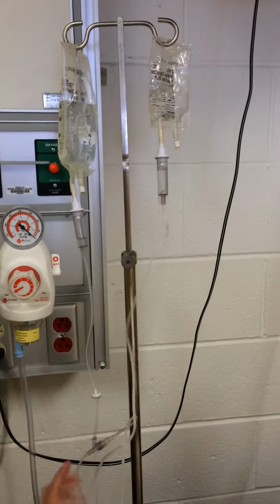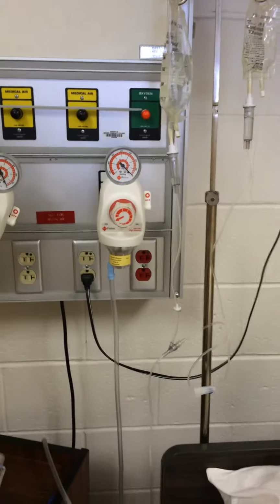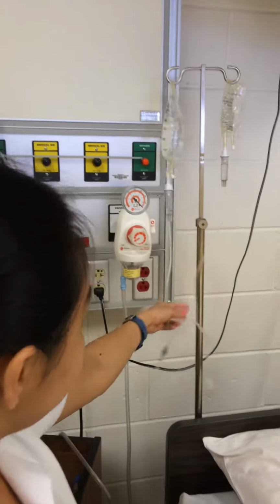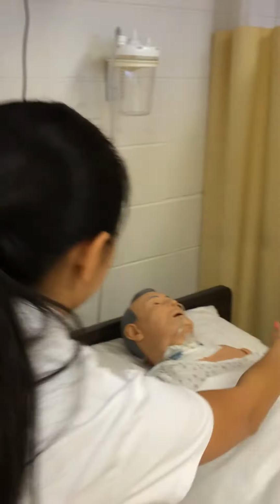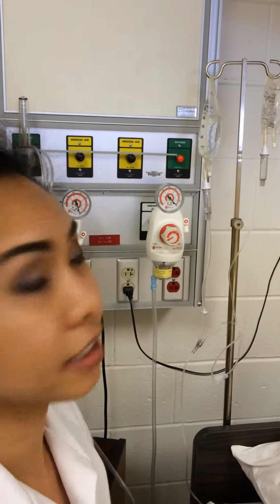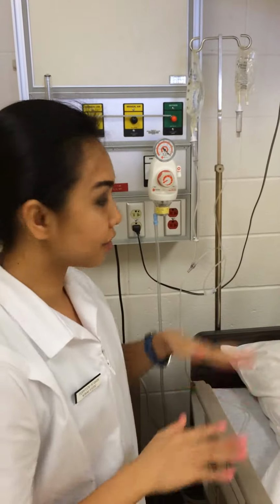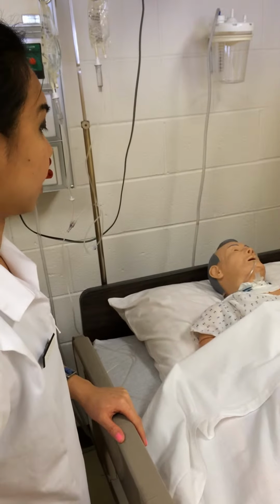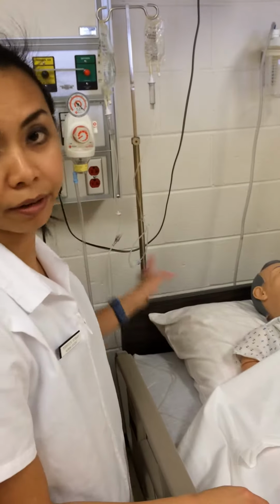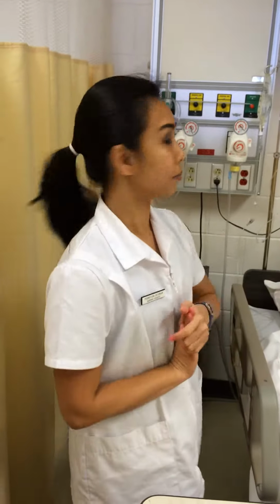Now I have already added the medicine to the primary IV. The physician order is 30 minutes. So I will make sure the patient is comfortable, and I lower the bed down, and the call bell is in reach. Okay. After that 30 minutes, I'll come back to remove the medication.